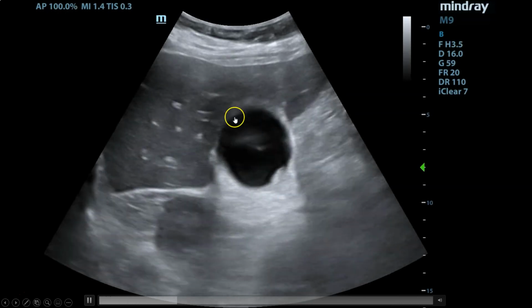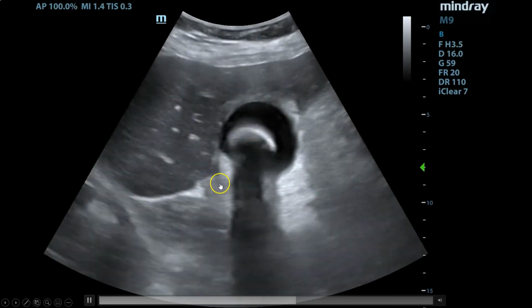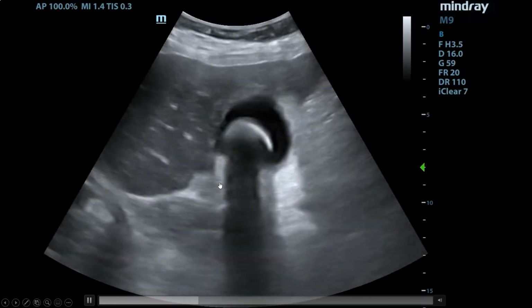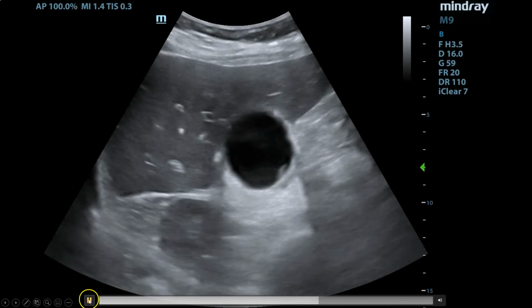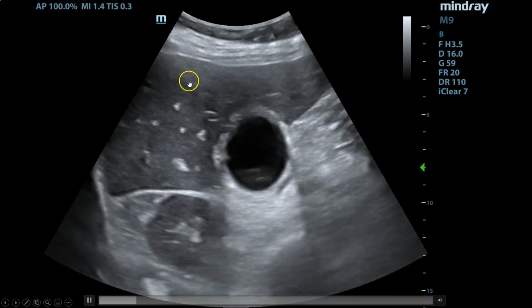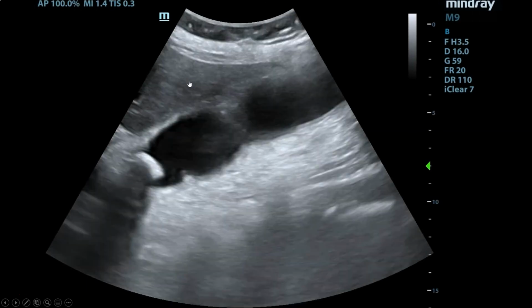The second question to follow is whether there's evidence of cholecystitis. And there, as we talked about, you're looking for pericholecystic fluid. And we'll talk about that momentarily. And you're also looking to see whether or not there is any gallbladder wall thickening. Let me show you this view in long axis now.